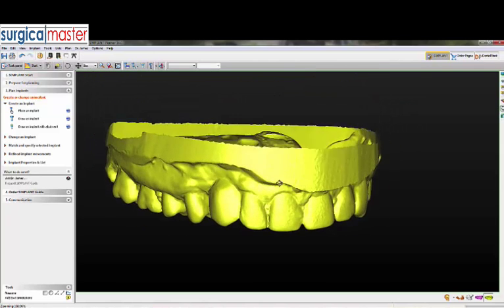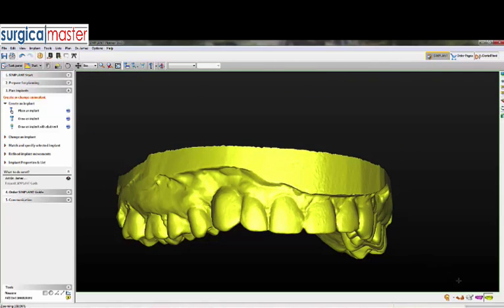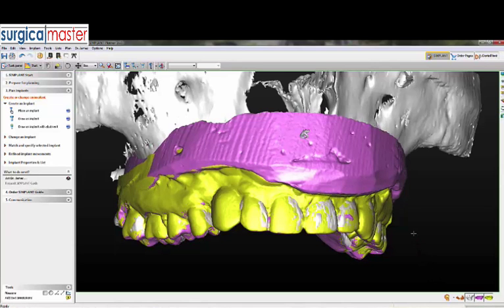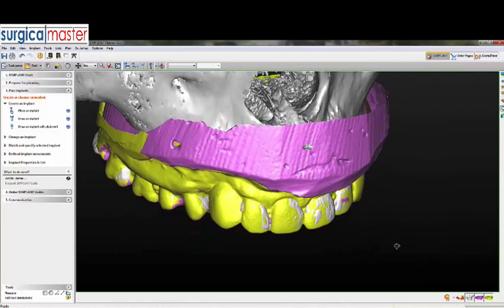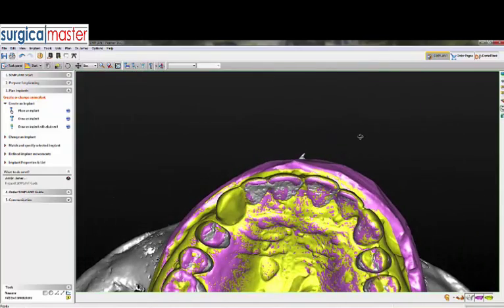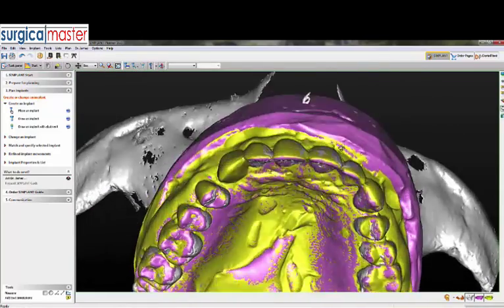Now we can merge all these sets of data — the wax-up, the edentulous area, plus the DICOM data — and we basically have a virtual image that we can plan with.